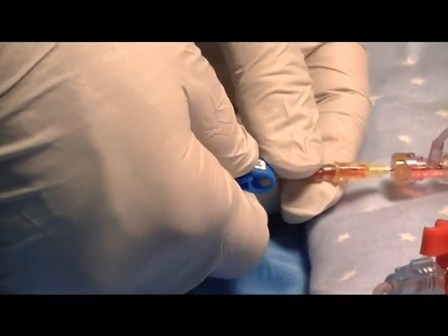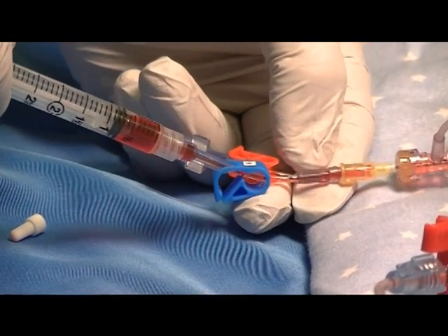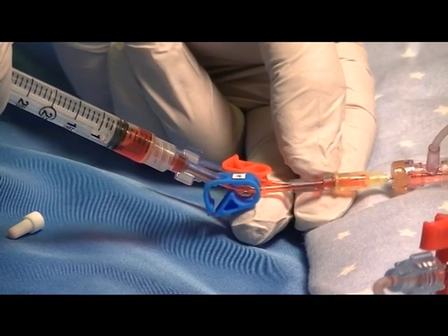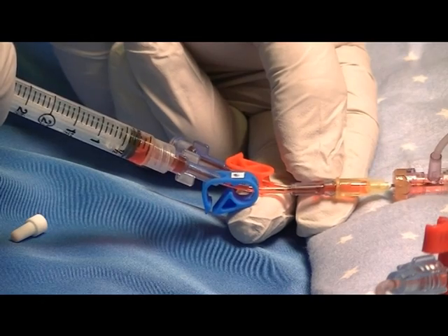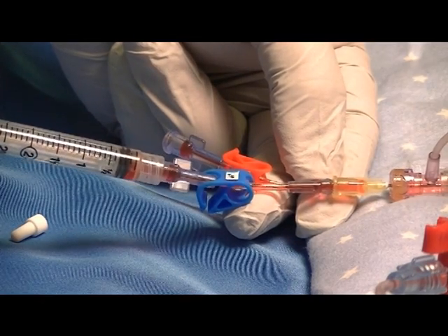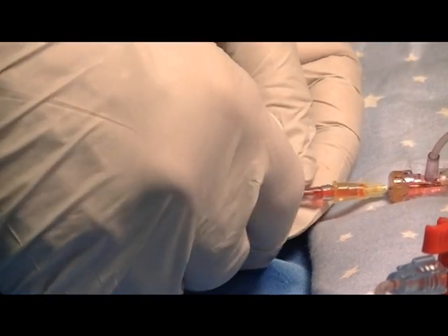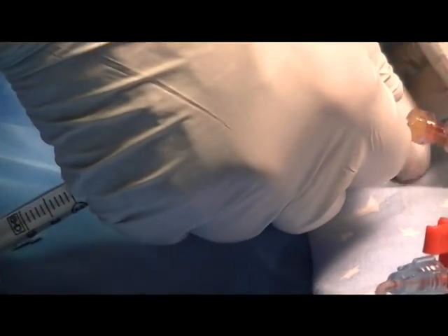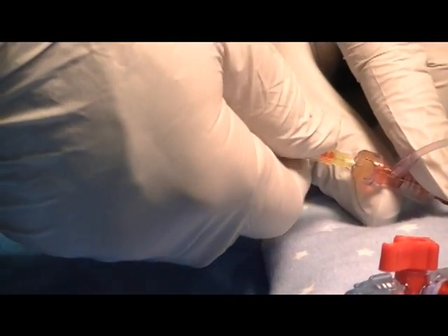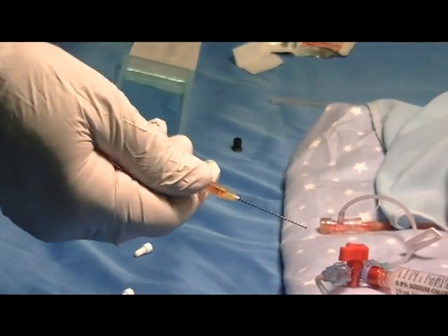Re-infuse the 0.5 ml of waste volume back to the patient, but not the air that's in the tip of the syringe. Re-clamp the device. Go to the T connector and gently and slowly remove the Hummey Microdraw device and dispose of it in the appropriate sharps container.